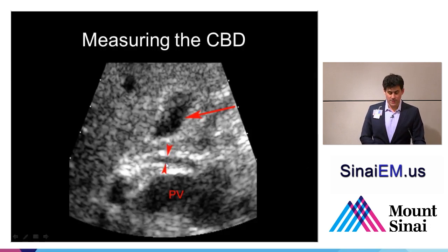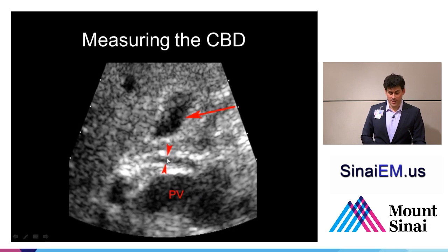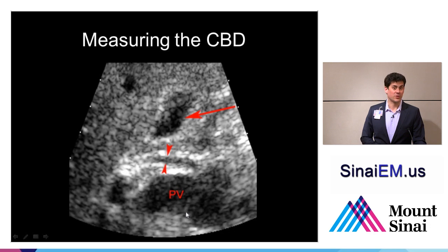We measure the common bile duct differently than the aorta. For the aorta, we measure outer wall to outer wall. For the common bile duct, we measure the inner wall — the inner diameter. Here we see it between the gallbladder at the top of the screen and the portal vein, which is the large anechoic structure behind, with the common bile duct between the two arrowheads.